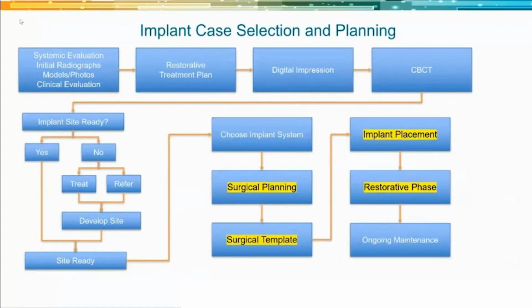So we're going to walk through the surgical planning process with the software and everything at this point. Again, guided surgery with cone beam, digital impressioning, and surgical guides, and with CCAT can work with many different implant systems. The sky's the limit. I will tell you, I limit myself to a few, but most specifically, the Astra EV system is what we're using today.